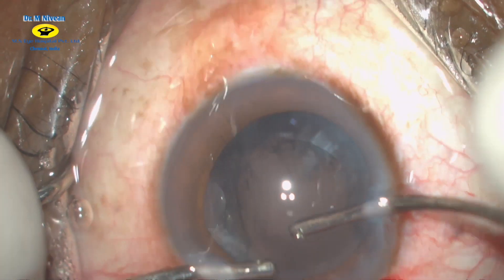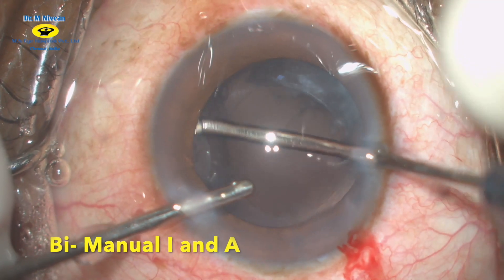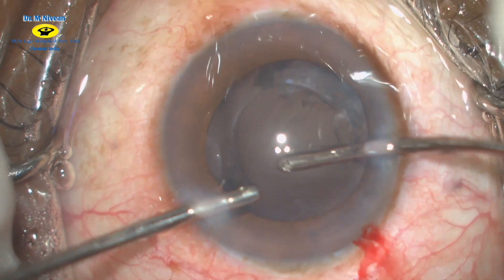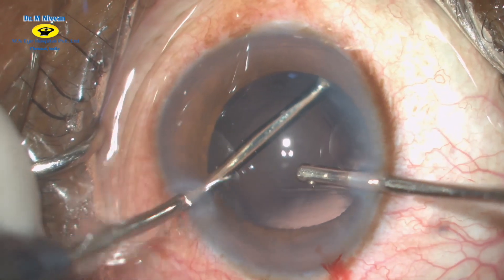Using bimanual irrigation, the cortical remnants are carefully removed. Since these cases don't have much cortex, irrigation-aspiration should be done very gently. The ports are changed and the remnant cortex is removed.